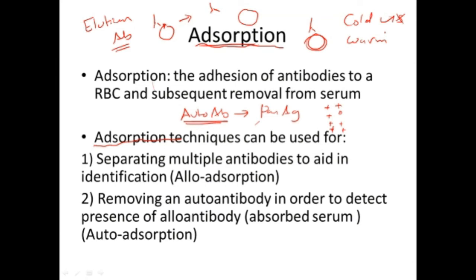Also, okay, so this is regarding patients with autoantibody. Also, can you remember when we talk about people with allo antibody? قلنا if people have multiple allo antibody, we can use different techniques to identify or rule out some of the antibodies. أعطوني بعض الأشياء اللي احنا درسناها. لما يكون عند patient عنده multiple antibody أكون أنا محتارة بينهم، أعطوني بعض التكنيكس اللي استخدمناها ممكن تساعدنا نحدد النوع.